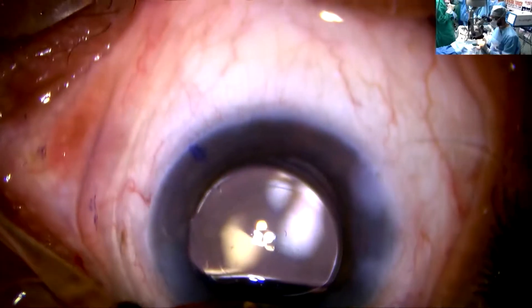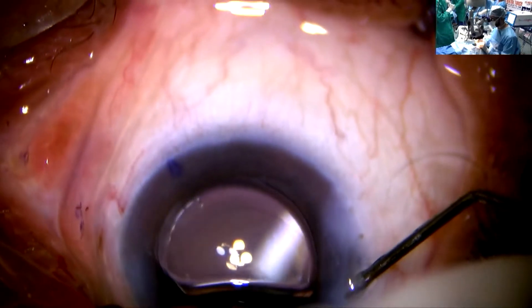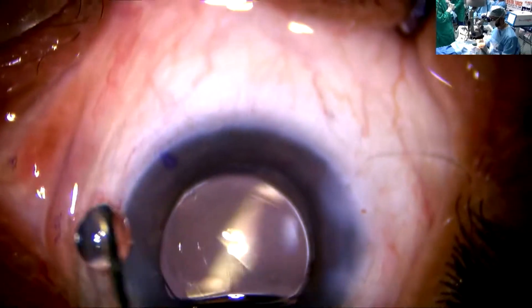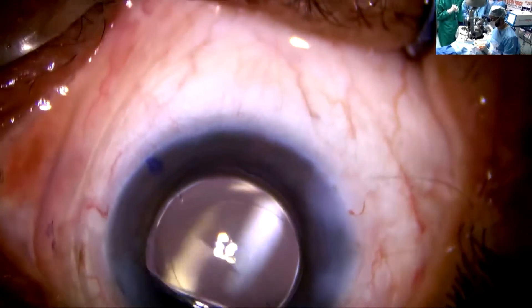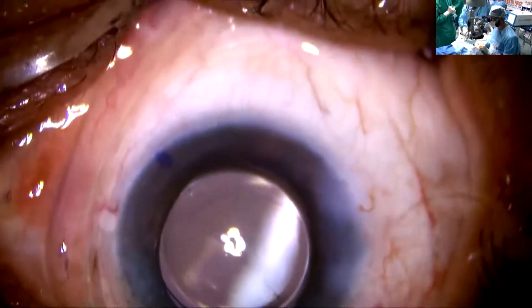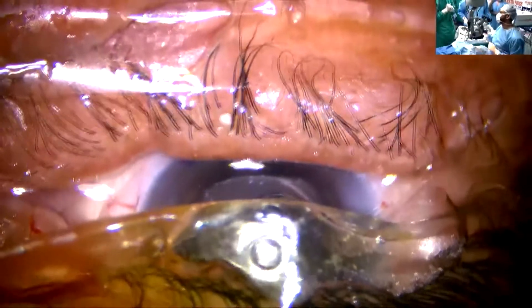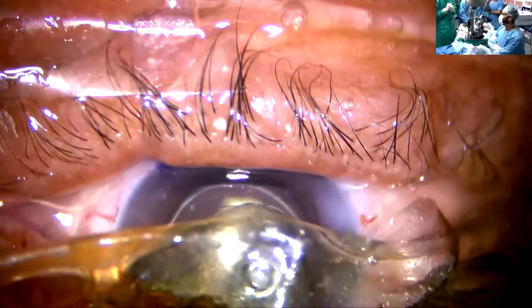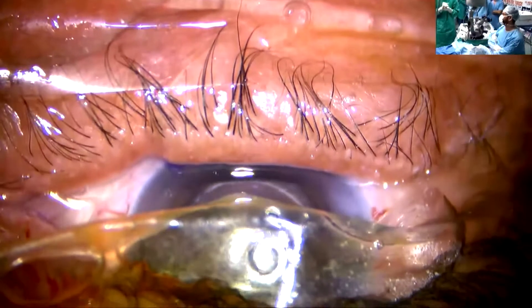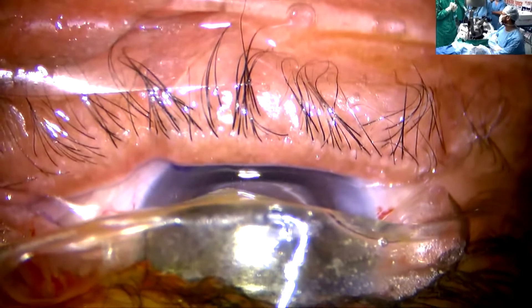Surgery is over. Is there any specific advantage of this intraocular lens? This lens has a double haptic and it prevents fenestration between the haptics, which usually get adherent. It prevents capsule overgrowth over the optics and provides excellent rotational stability. I have implanted more than 50 lenses so far and none of them have shown any rotation after surgery.